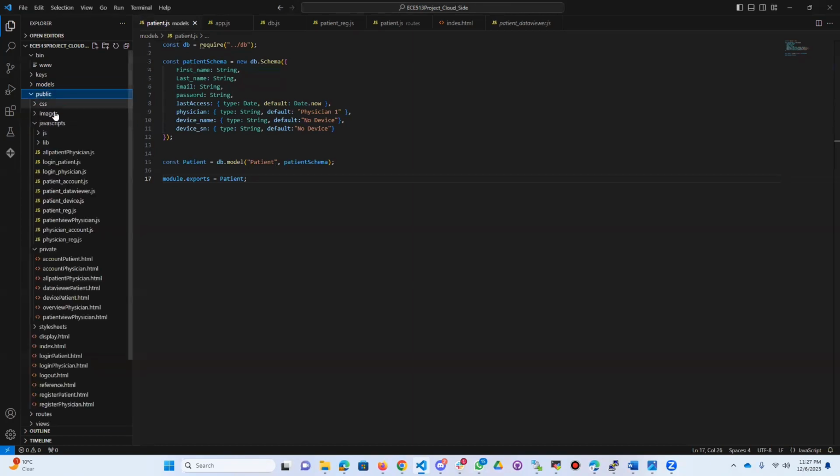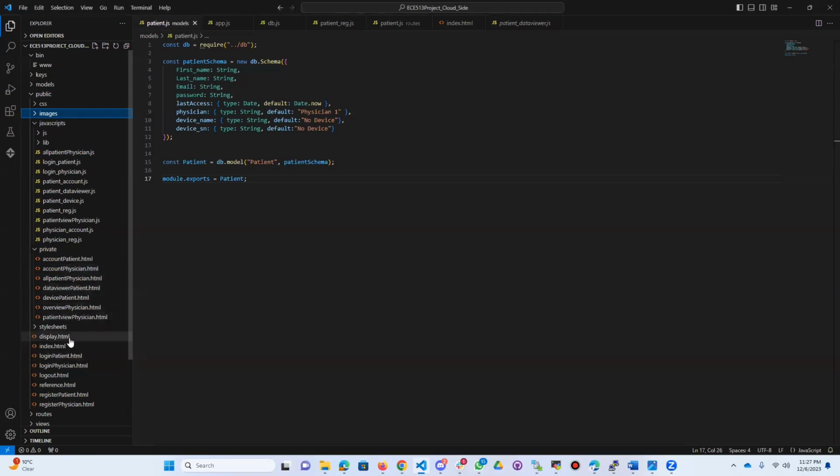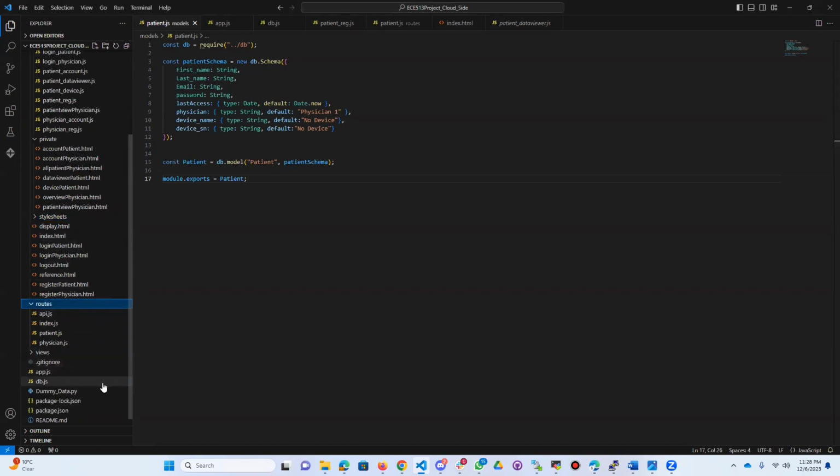And it has public, where you have the CSS style sheet and the images used here, logos, and the JavaScript file. The private folder contains all the HTML files that come after the login. We keep it separate, and the style sheets are all the CSS style sheets here to make the display look nicer. And all the HTML files here represent all the pages that I have just shown. It has routes and app.js, db.js, package.json, and everything.